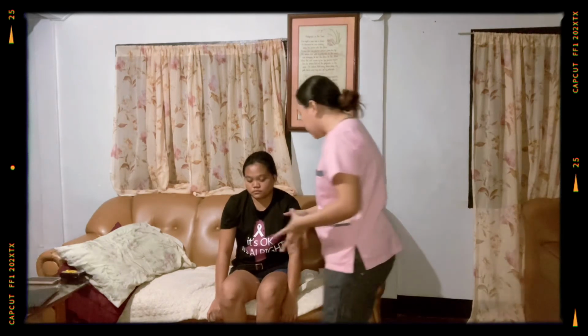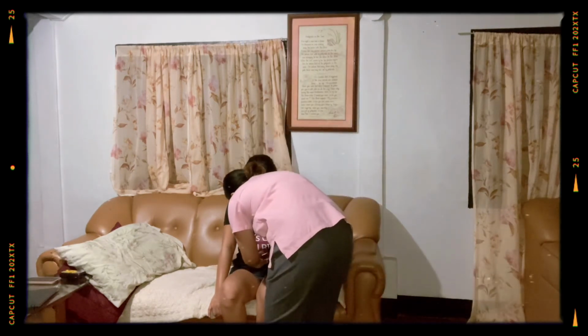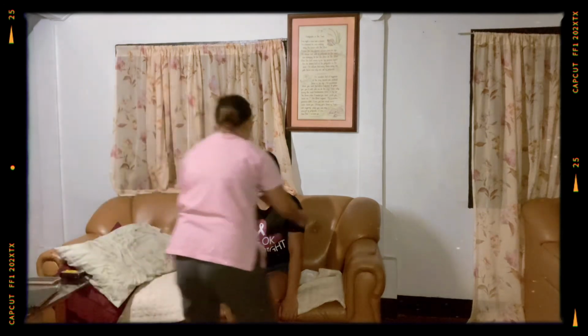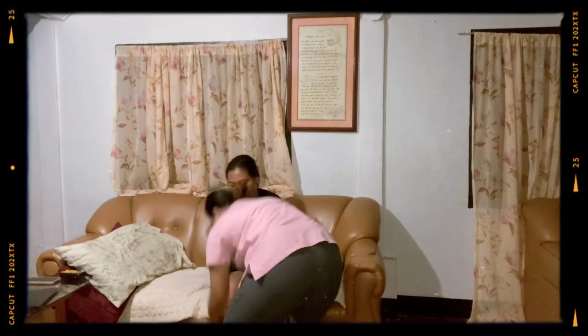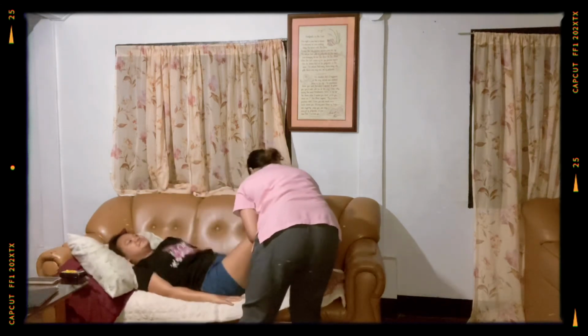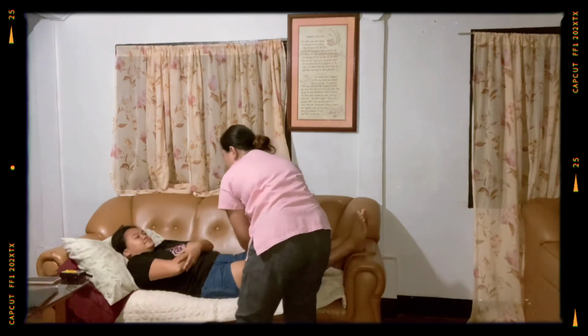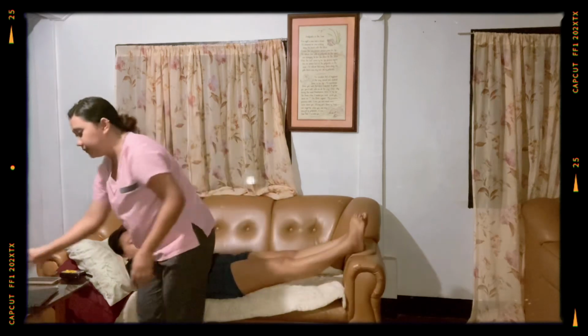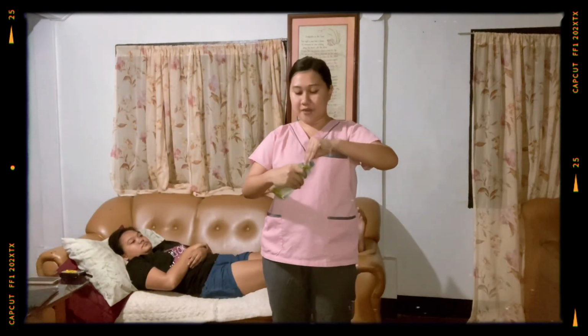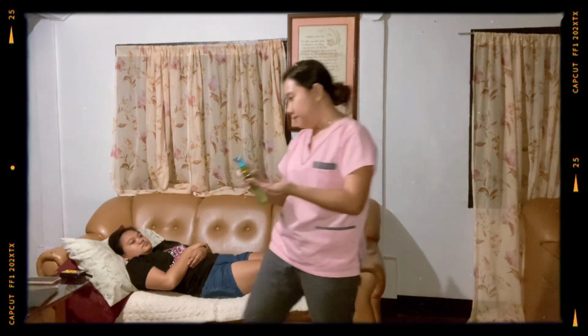So, first we are going to remove the gait belt and put the patient in a comfortable position. Okay, ma'am. So, we are going to use an alcohol-based hand rub to prevent the spread of microorganisms.